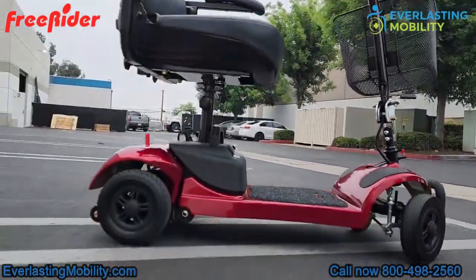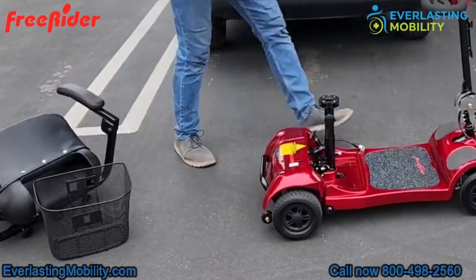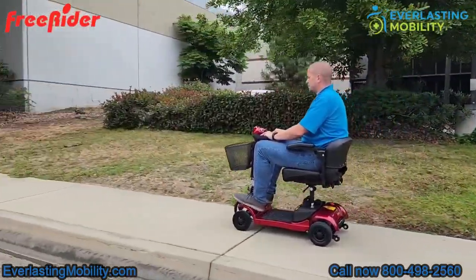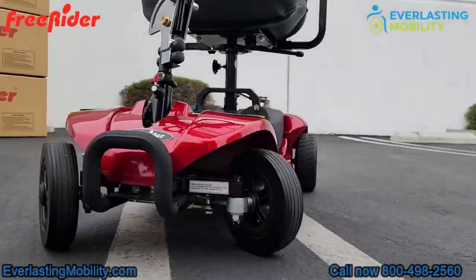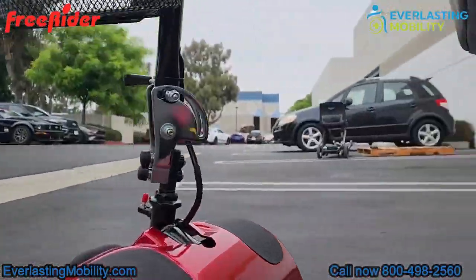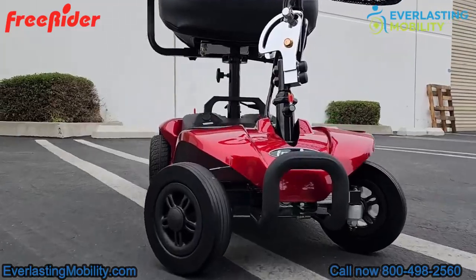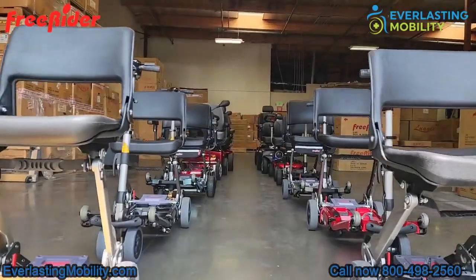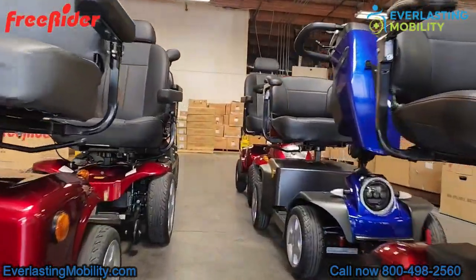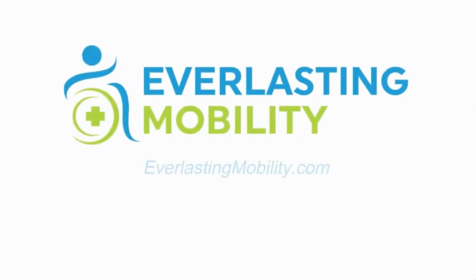What sets the Ascot 4 apart is its genius design — it disassembles effortlessly into five manageable parts with the heaviest piece weighing just 33 pounds. Despite its compact nature, it supports a higher weight capacity than most and has a battery range of up to 15 miles on a single charge. It also features an 18-inch comfortable padded seat, a regenerative braking system, and a convenient off-board charging battery pack. Freerider is backed by over 25 years of service, and each purchase comes with a stellar warranty and unparalleled support. For questions, call 1-800-498-2560 or visit everlastingmobility.com.